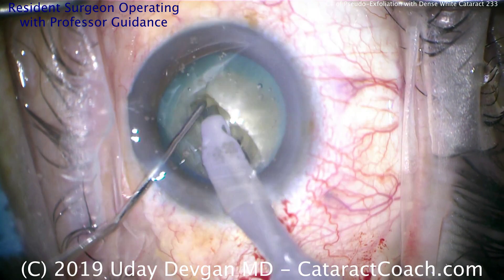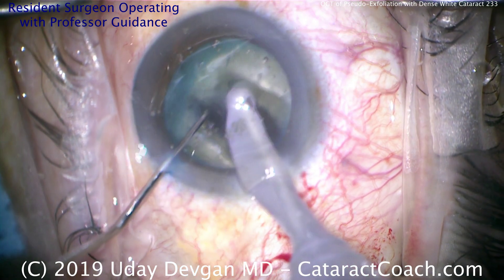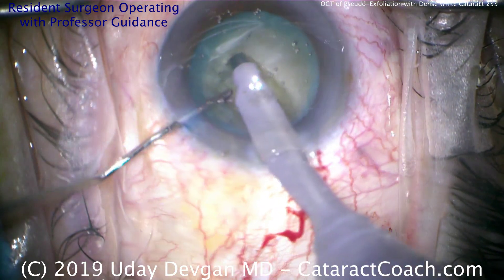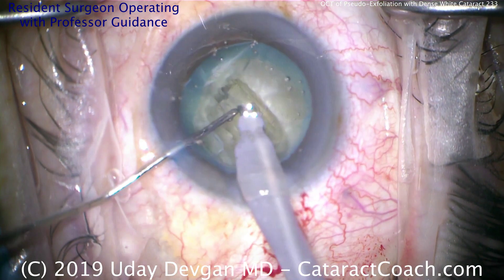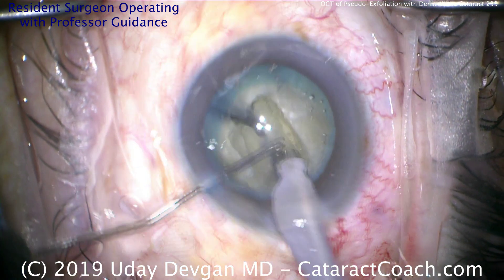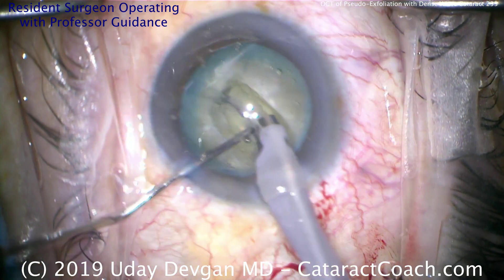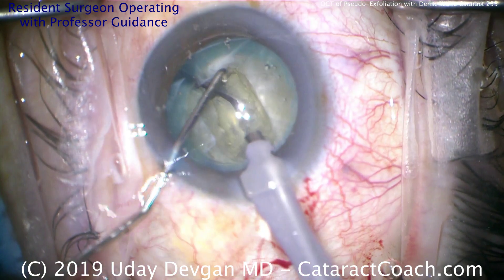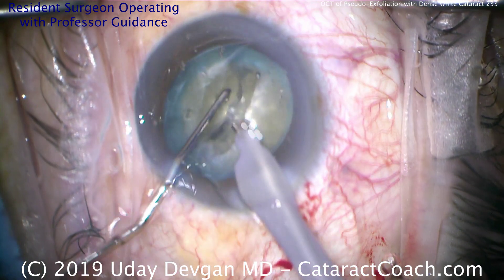Make sure we propagate the crack fully to the end — that looks great. You really have to have the two pieces completely free from each other, like we have now. At this point you can try to bring up a piece, and we can rotate it first. Now you see completely two halves — that's for sure split. Rotate the nucleus to position it a little bit better.